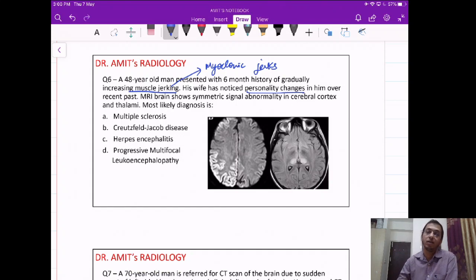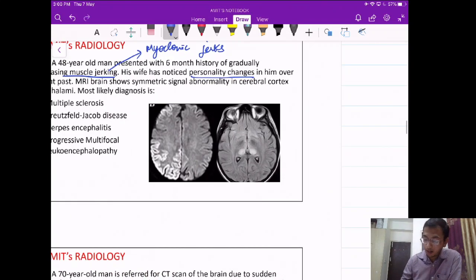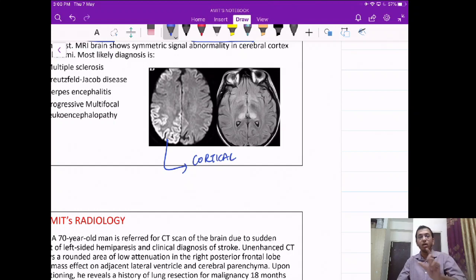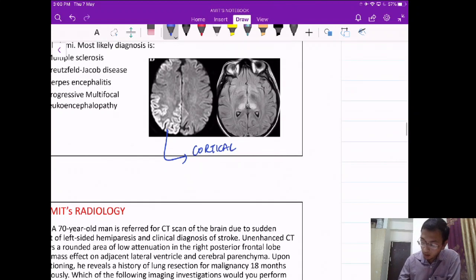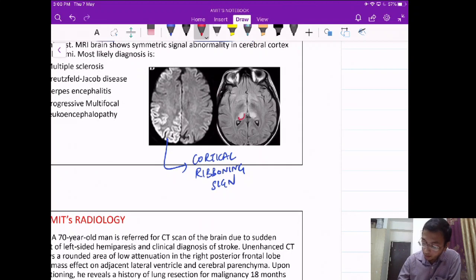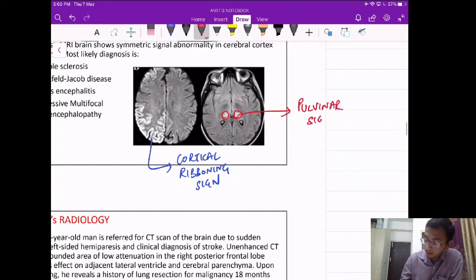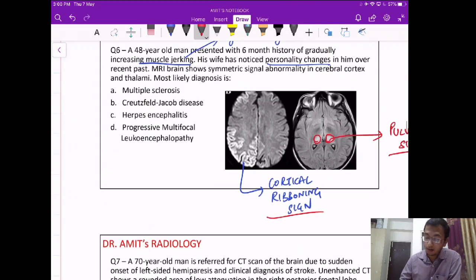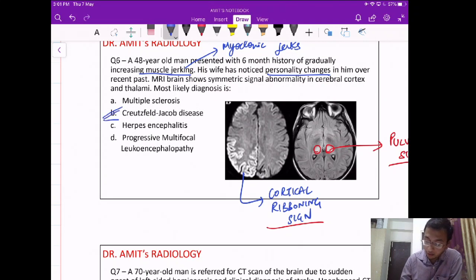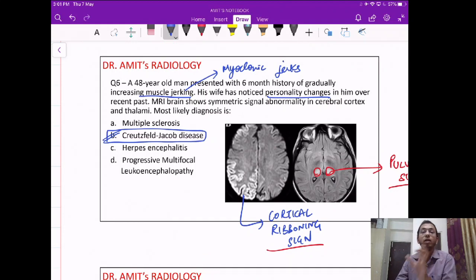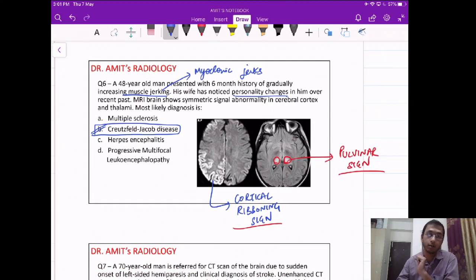The imaging findings: the first image shows cortical ribboning — altered signal intensity around the cortex — known as the cortical ribboning sign. There is also altered signal intensity in bilateral thalamus known as the pulvinar sign. Both signs are characteristic for Creutzfeldt-Jakob disease. Clinically, CJD shows myoclonic jerks and rapidly progressive dementia; on imaging, cortical ribboning sign and pulvinar sign are the characteristic findings.